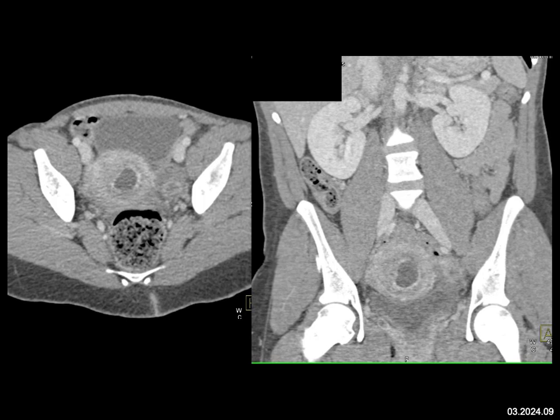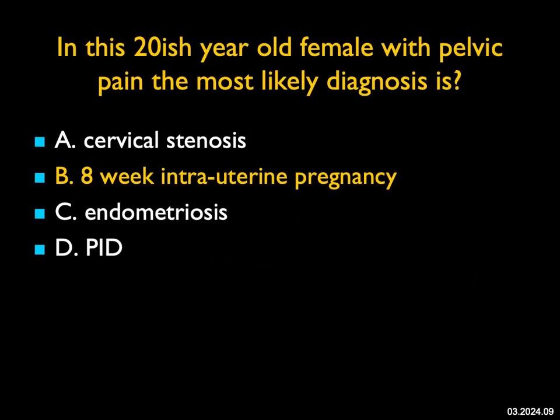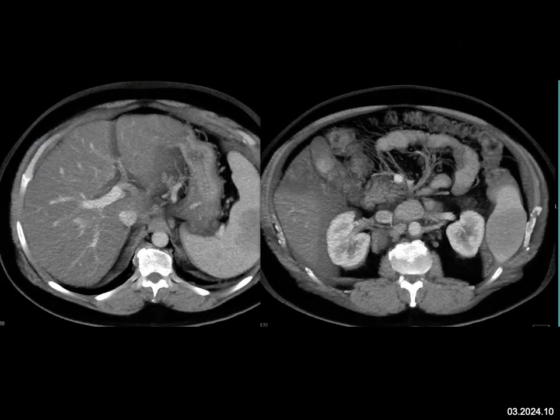In this 20-year-old female with pelvic pain, what's the most likely diagnosis? The uterus has a low-density zone centrally with rim enhancement, seen nicely on axial and coronal views, with minimal free fluid. This is not cervical stenosis — it would be more dilated and you wouldn't expect rim enhancement. It's not endometriosis, which usually shows pelvic masses simulating ovarian masses. It's not PID — there's no inflammation. This is a classic appearance of an intrauterine pregnancy. On ultrasound this was confirmed as an eight-week intrauterine pregnancy.